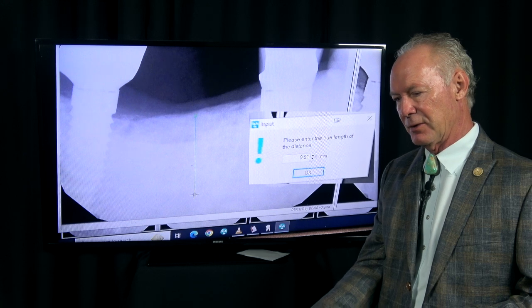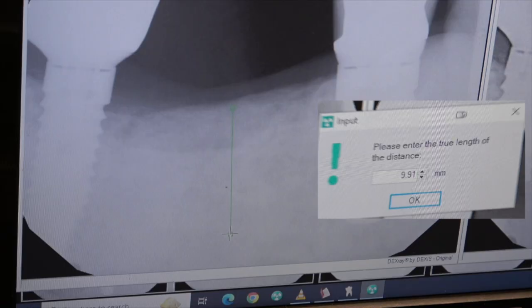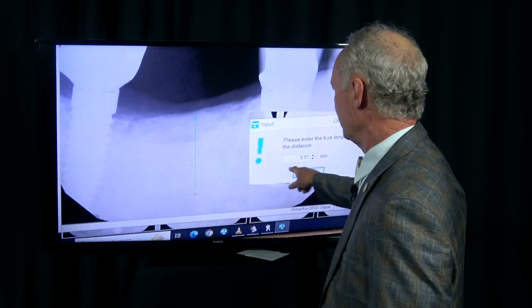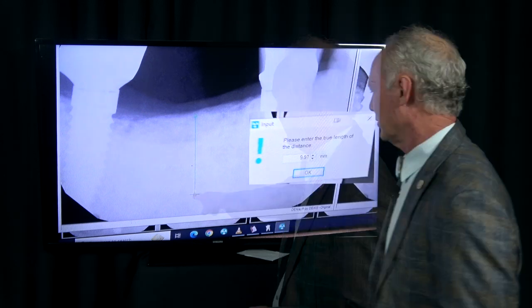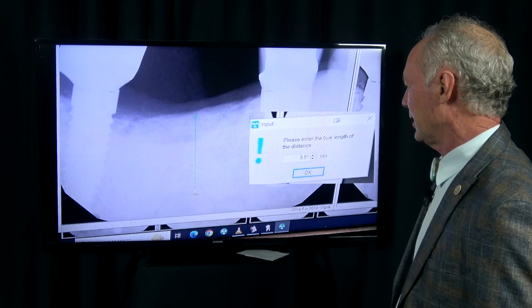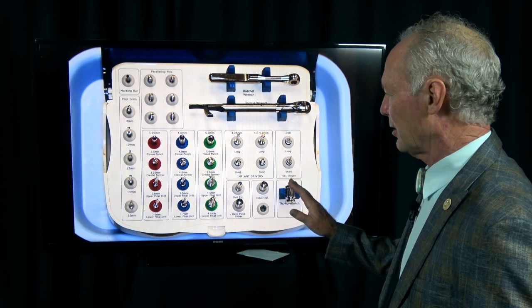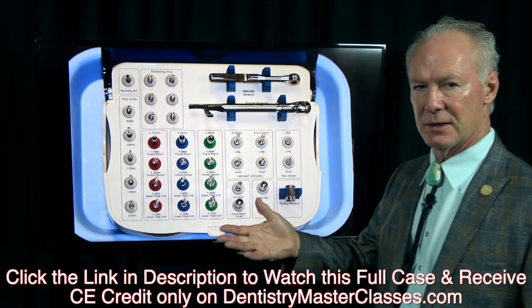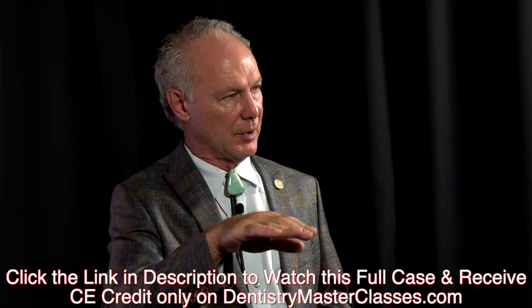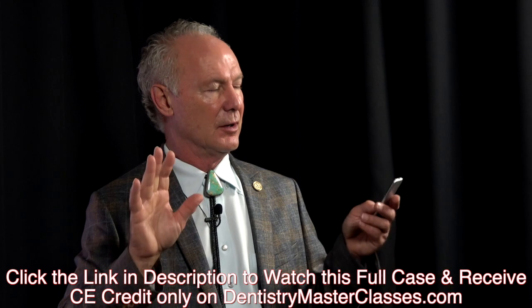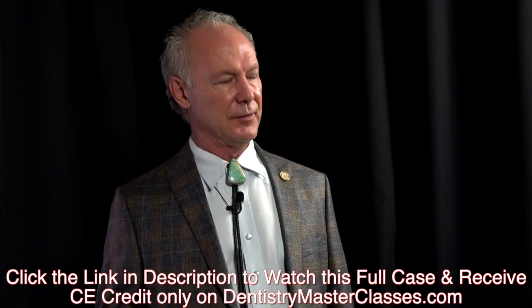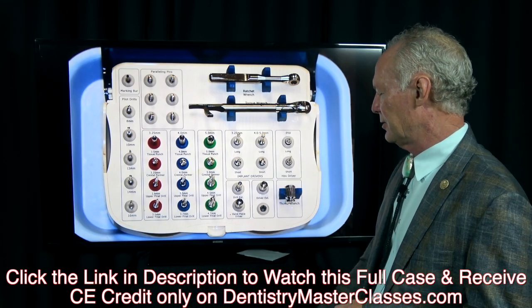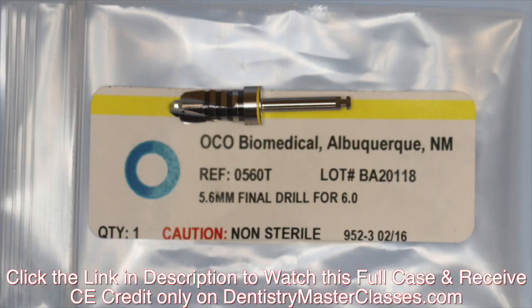One of the keys of placing a mandibular implant is don't go too deep. You don't want to damage the inferior alveolar nerve, but you also don't want to drill past the undercut on the apical part of the mandible on the lingual side. I'm taking a periapical radiograph and I've got approximately 10 millimeters from the alveolar crest to the coronal part of the inferior alveolar nerve. I start with just a thin pilot drill, going short of that known distance just to not take any chances on drilling into the nerve.